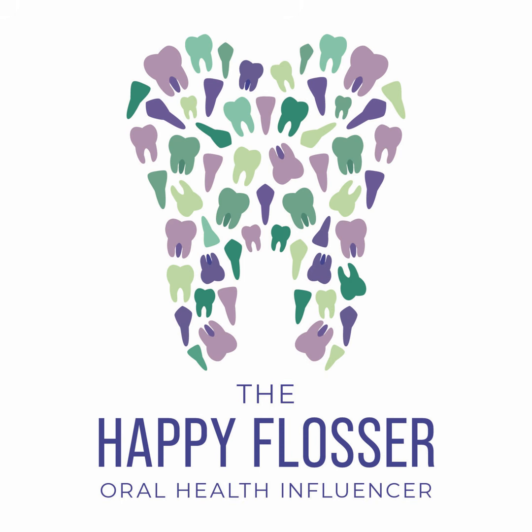And the intention for that is to really get you looking at your radiographs in a comprehensive way so that you are better equipped to note your findings or notice a change in something that might otherwise be considered normal or overlooked. Don't get yourself just focused on the periodontal diagnosis and the clinical attachment loss with your patient. Really focusing on the patient as a whole when you're looking at those radiographs goes a long way.